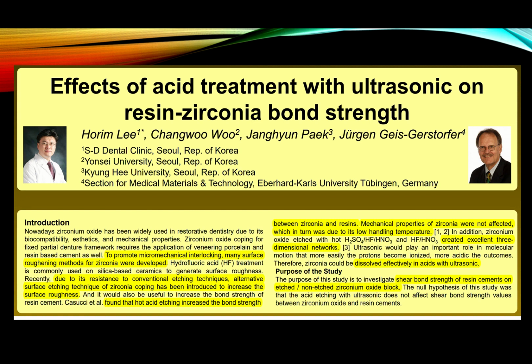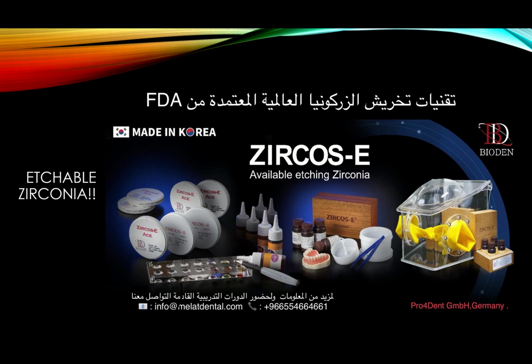But the thing is, like I said, you are doing something that's new with etching zirconia to promote the cementation. Does that affect the physical properties in the long run? They obviously in this study proved that the mechanical properties of zirconia were not affected, which in turn was due to low handling temperatures. But we want to see the effect of it in the long run. But yes, people started etching zirconia, and I will show you.